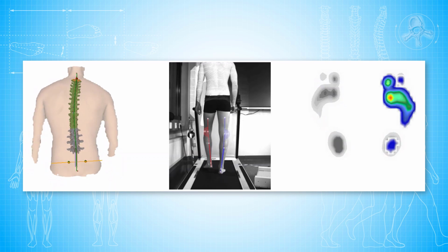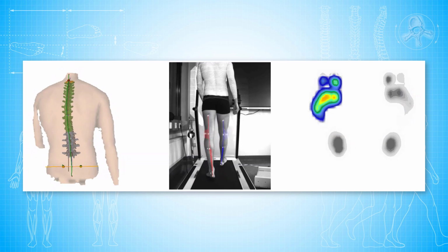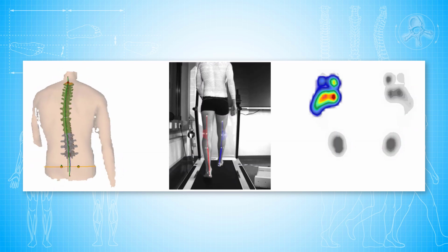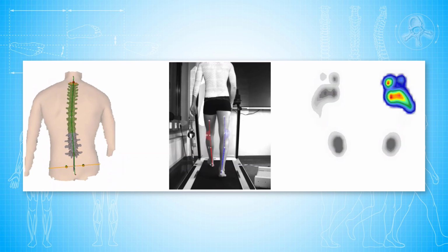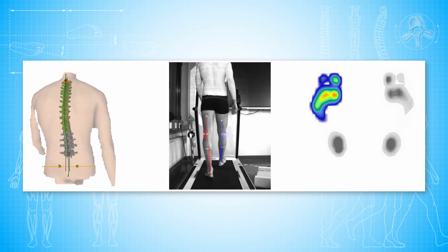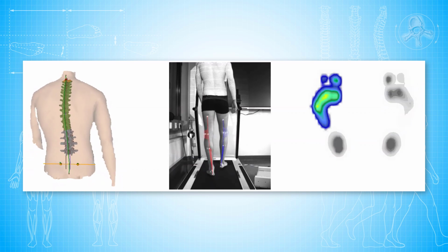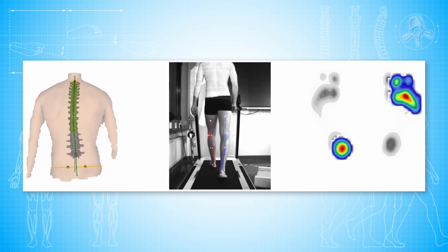Let your patient get used to the treadmill situation first and plan a few minutes for this habituation process before the first measurement. After all, you want to evaluate a gait pattern that is as habitual as possible. This also includes choosing the appropriate treadmill pace. Do not approach the choice of speed too timidly. Most patients will have just as much trouble establishing a stable gait pattern if the speed is set too slow as if it is set too fast.